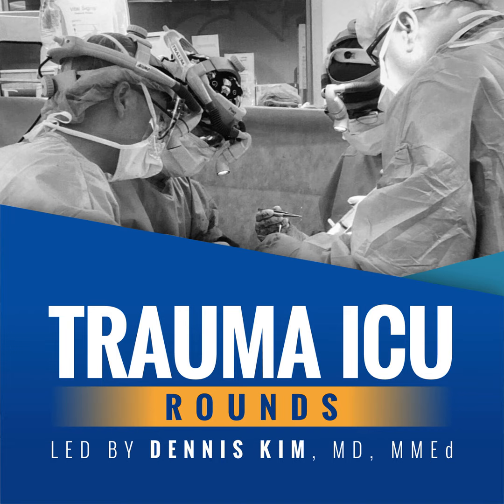In that particular setting, it probably makes no sense in the ER to place this patient on SIMV, as we're looking to provide this particular patient with full ventilatory support to decrease demand and improve overall systemic oxygenation. However, as patients improve and get better, there will come a time where we do want the patient to assume some part of the work of breathing by actively breathing in an effort to preserve some amount of respiratory muscle strength and work towards liberating our patients off of the ventilator.